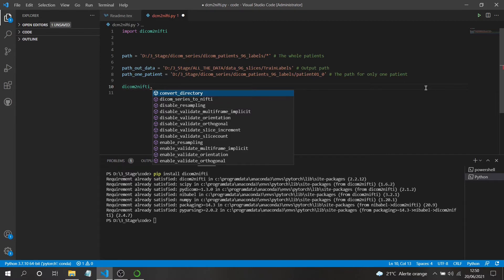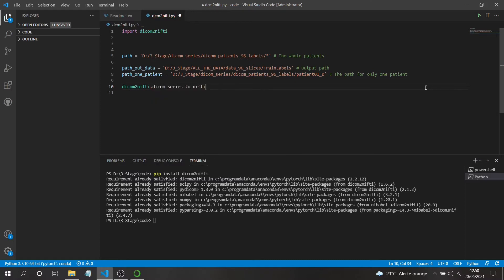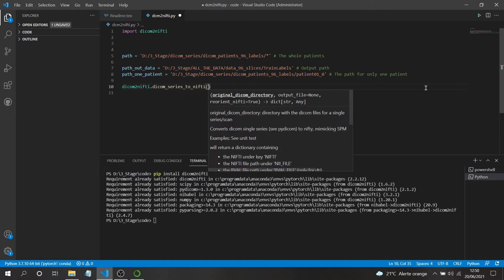If you want to convert more than one patient using converts_directory, you can't change the output filename each time, so all patients would end up with the same name and overwrite each other. I recommend always using dicom_series_to_nifti because it does the same thing but gives you control over naming the file. You don't even need the other one.